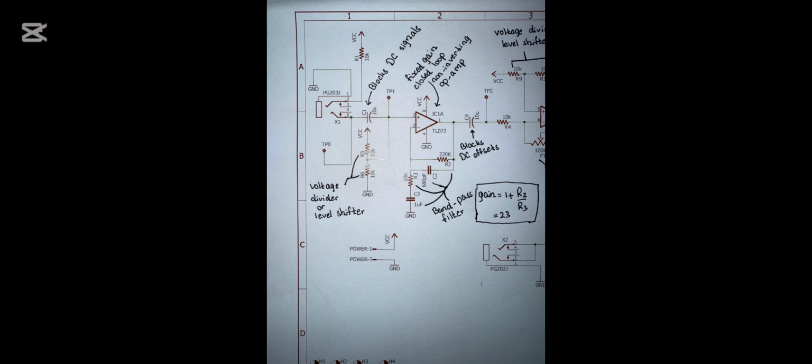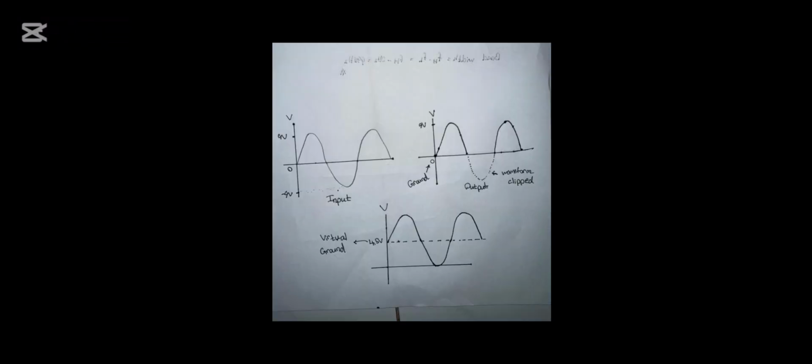The passband gain formula for a non-inverting amplifier is 1 plus R2 over R3, and finally we got a gain of 23. In this part, since we are only using single supply mode, it will cause the negative cycle of the AC signal to be clipped off. To prevent this, the voltage divider R5 and R6 also functions as a level shifter, and it provides the virtual ground of 4.5 volts for the AC signal to swing around. So the amplified AC signal is riding on a DC offset of 4.5 volts, and it is passed through C4, another coupling capacitor, and hence blocks the DC offset.